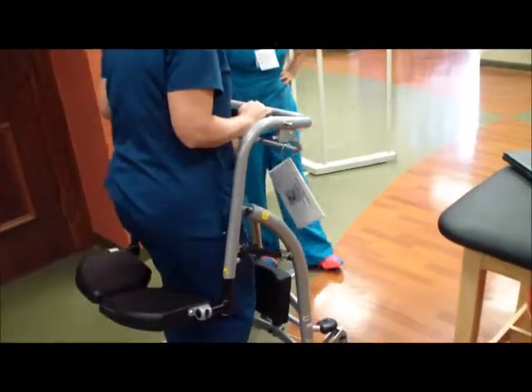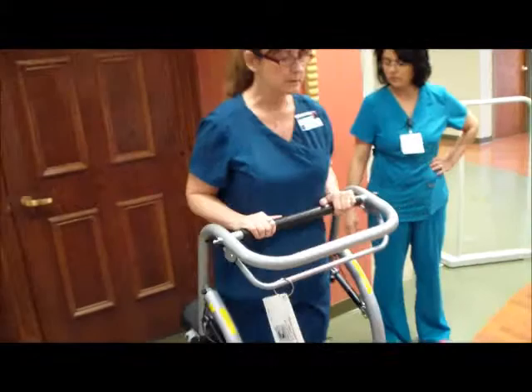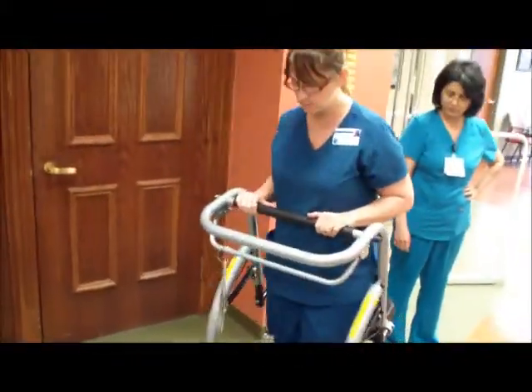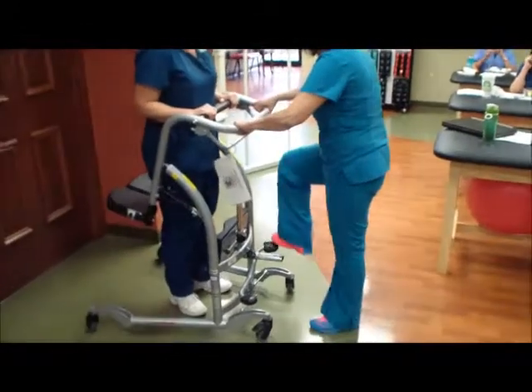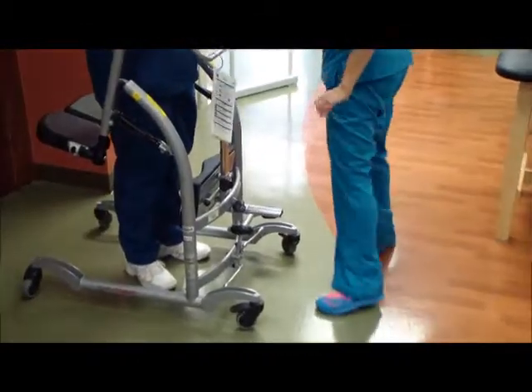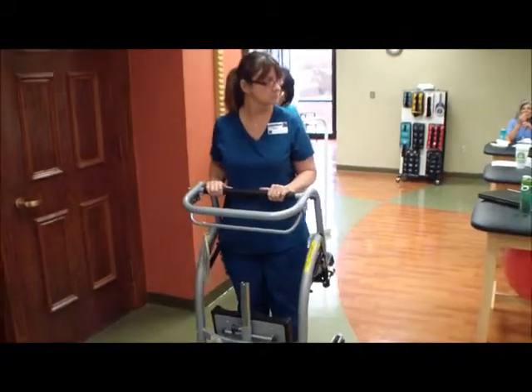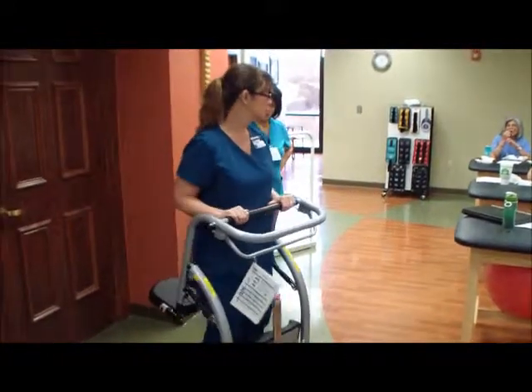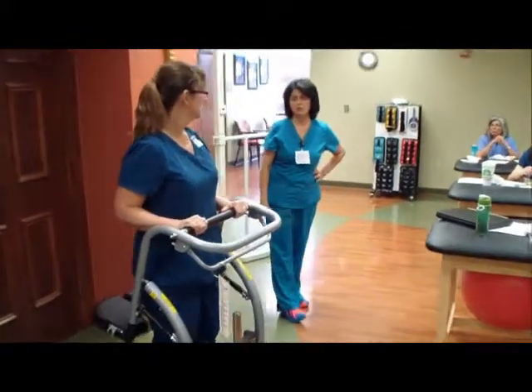And it mobilizes very well. It can get into small spaces, so this could be good for getting into a bathroom. That'd be ideal for that. Narrow it before you're going into the bathroom. Any questions? We go right over the toilet. It's a little more tricky to get it to the shower areas in most of our hospital rooms. But over a bedside commode, you could do that.